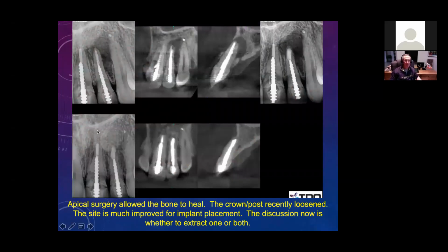Sometimes in planning ahead, we'll do procedures in anticipation of loss of the teeth in adults also. This patient had very extensive, kind of poorly done crown and bridge, and we were anticipating that these maybe didn't have that many more years to go. The endo was failing here. There was a fairly large radiolucency.